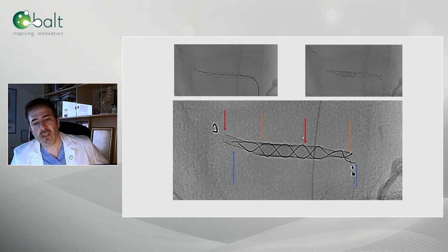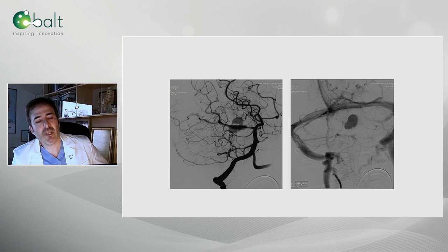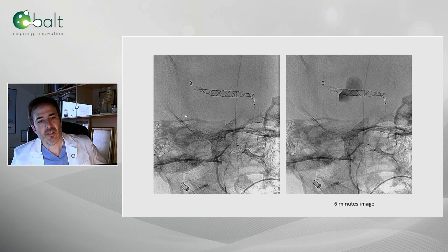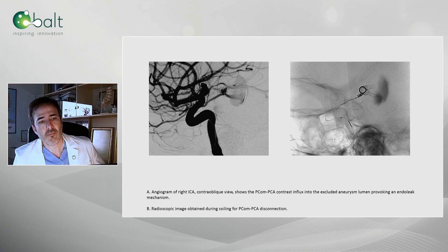On red, the ends of the more distal one. On orange, the ends of the second one. This is the immediate result. You can see here some white stuff that is in fact the entrance of blood through the carotid. This is the construct. This is the stagnation of contrast into the aneurysm, obtained after six minutes of angiographic imaging.